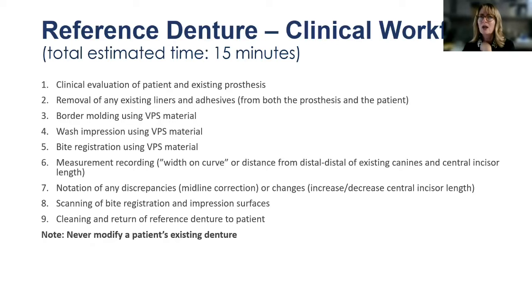wash impression. We have also had success with dentists doing a chairside reline and letting it fully cure. I'm going to make that statement, letting it fully cure and then scanning that instead of a wash impression. So that might not happen that day, right? You might do the wash or you might do the chairside reline and then have them come back in a week to scan the actual soft reline.